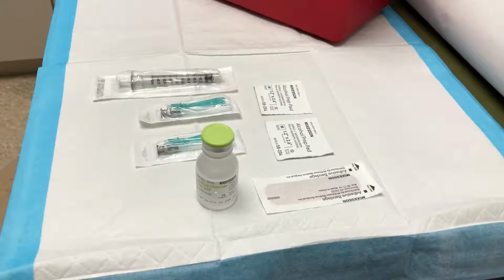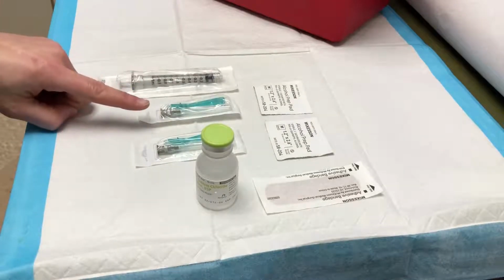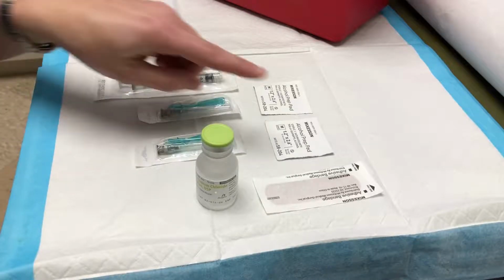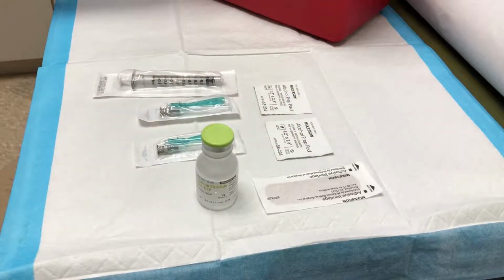For each injection, you should have a clean flat surface, clean hands, your medication, a 1 ml syringe, 2 needles, one for drawing up your medication and one for your injection, 2 alcohol prep pads, one for cleaning your vial, and one for cleaning your injection site, a Band-Aid, and a sharps container for your used injection supplies.